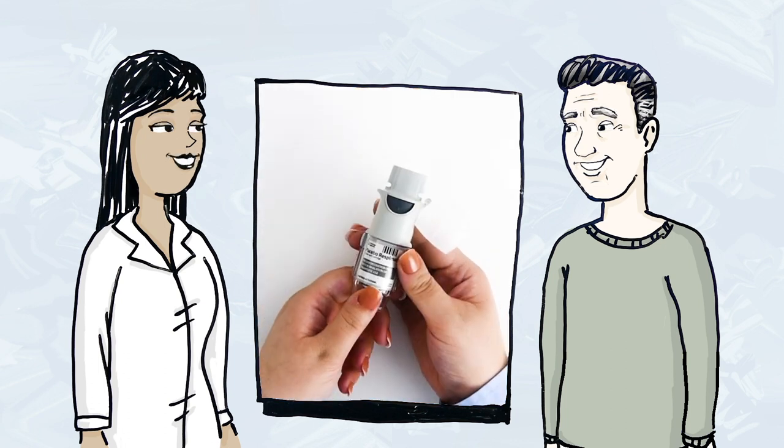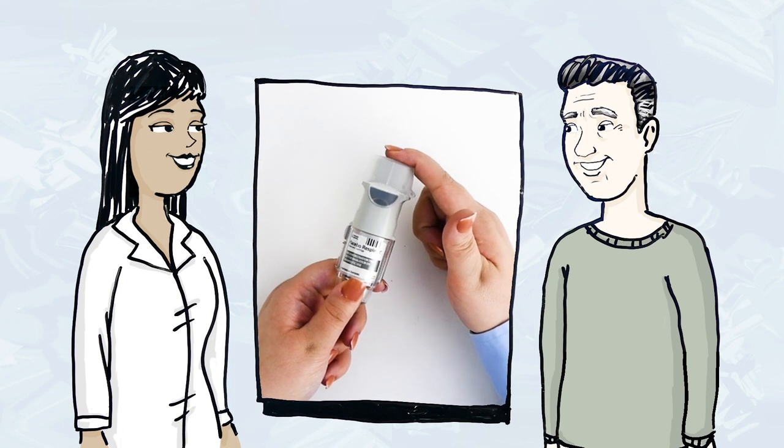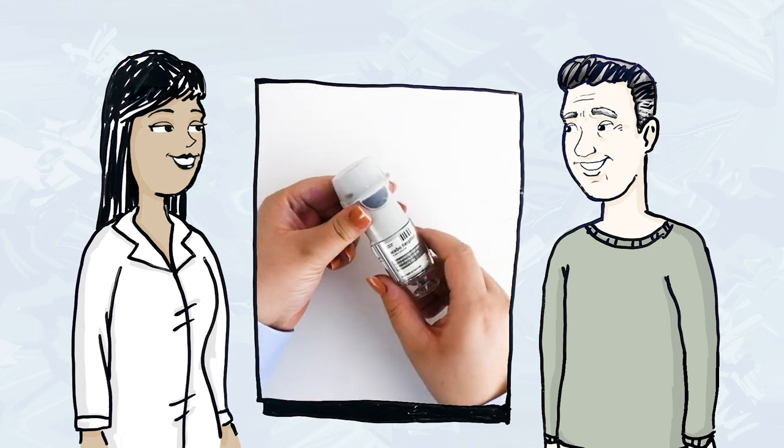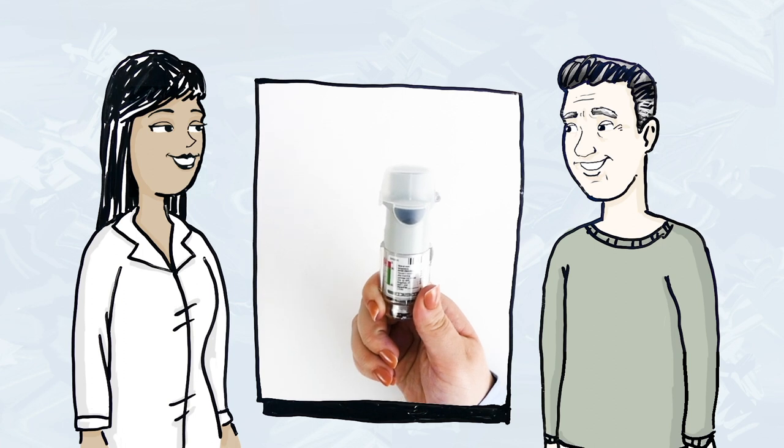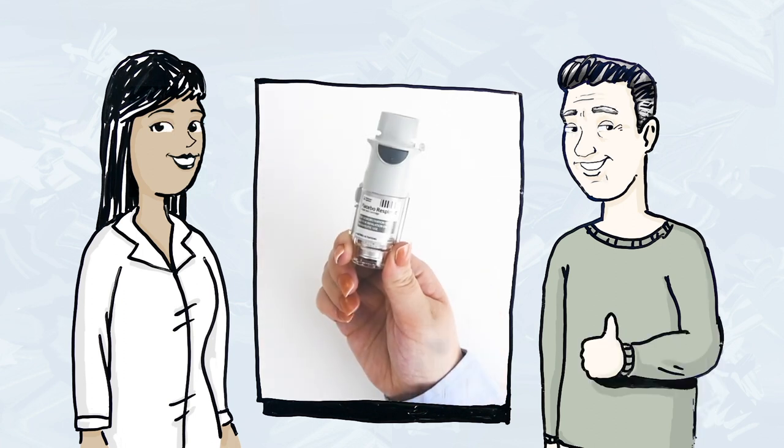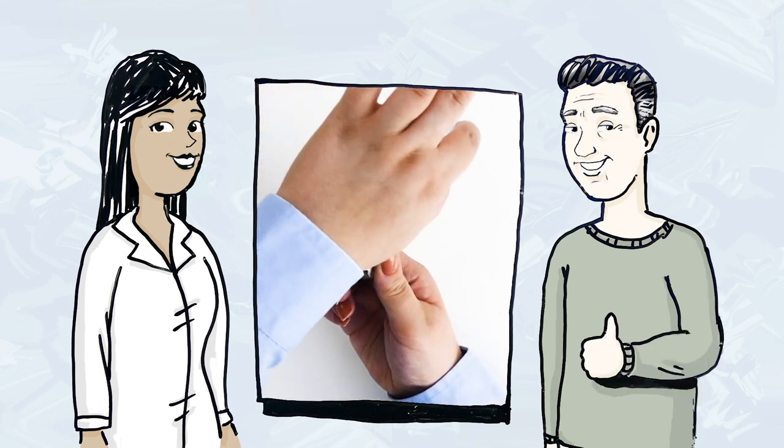Between each spray, I remind Henry to close the cap and turn the base until he hears a click. The arrows on the label are there as a reminder of the direction the base turns. Henry's inhaler is now ready for daily use.